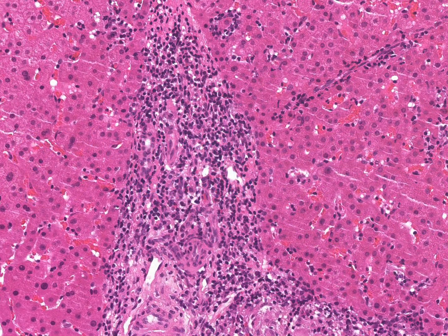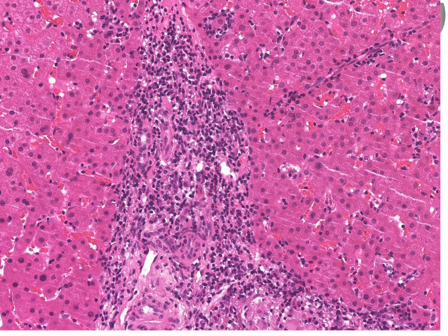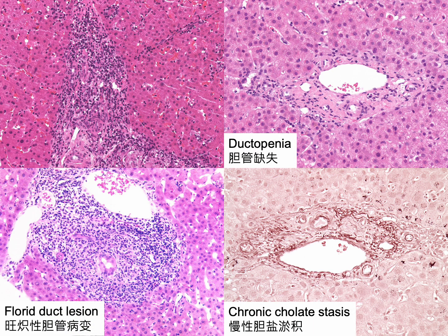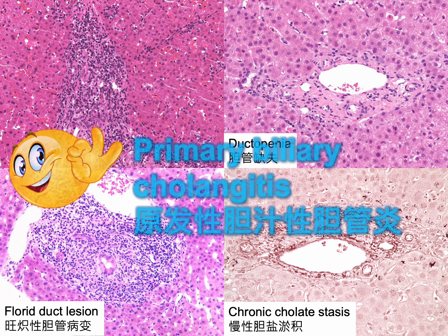In this example, the portal tract is also expanded by a lymphocyte predominant infiltrate. If we recognize a florid duct lesion, ductopenia, and chronic cholate stasis, we could secure a diagnosis of primary biliary cholangiitis in a patient with elevated alkaline phosphatase or seropositivity for AMA.